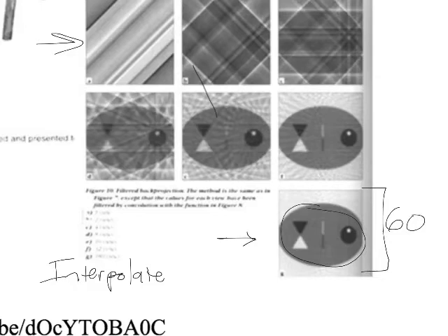The other thing that's interesting about this is, we've mentioned that the image data now accurately spatially represents what's going on inside the cow's brain, right? It now accurately spatially represents the little squares and circles the cow is thinking about, or really just the anatomy of the cow. It doesn't actually see what the cow's thinking, but the anatomy, right?